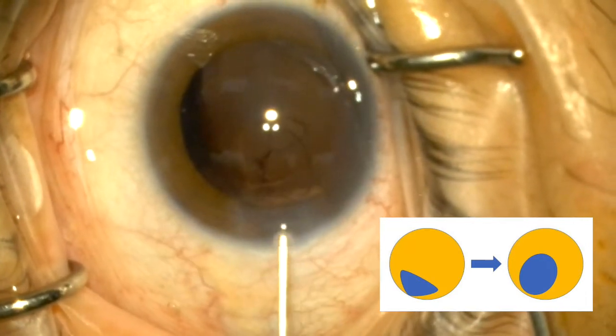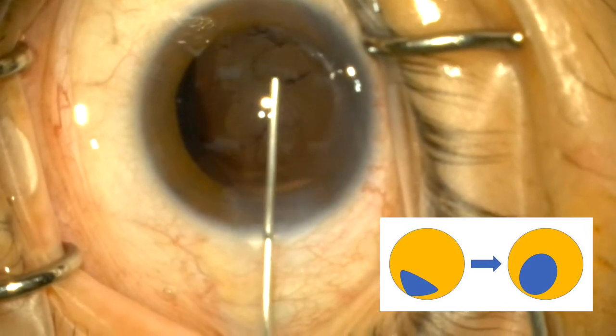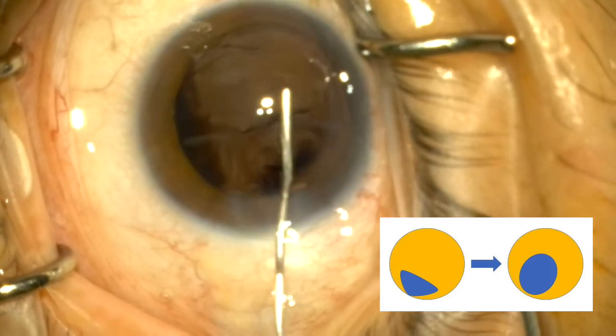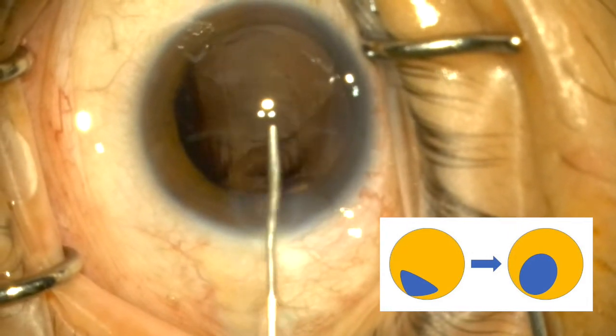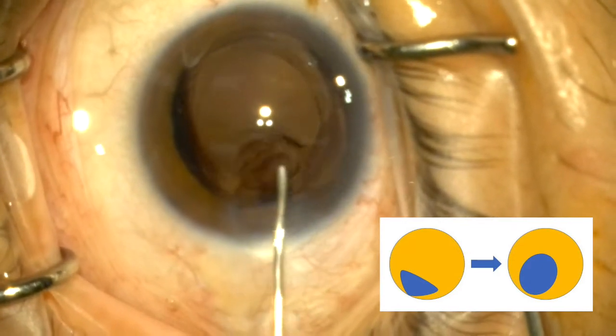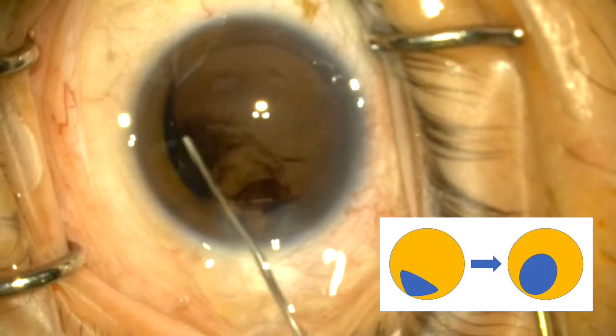My plan is to convert this into a posterior curvilinear capsulotomy. I injected viscoelastic to tamponade the vitreous that may be prolapsing from the PC rent area. Remember not to over-inject viscoelastic as it may cause an extension to the PC rent in an uncontrolled fashion.